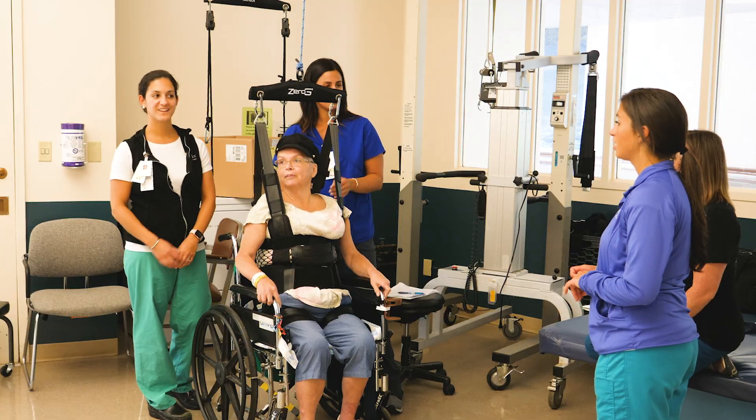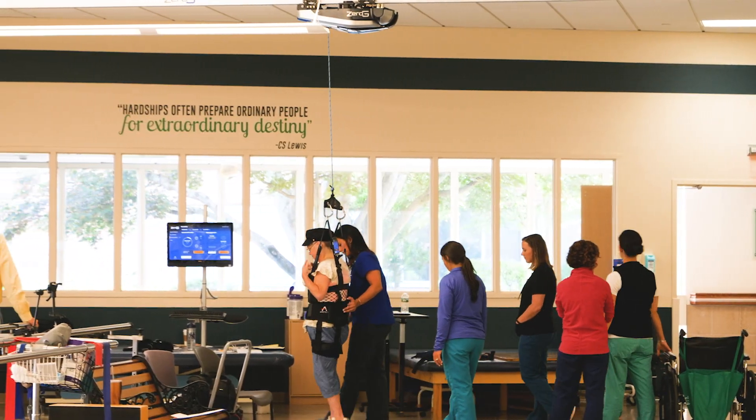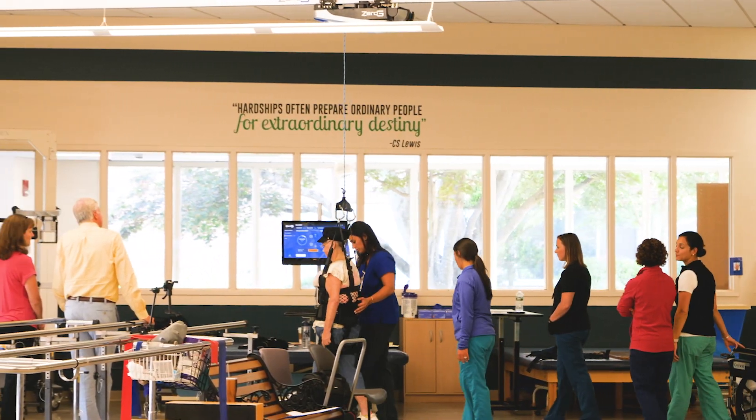Those patients that might have a fear of falling can now get up and you can show them that they physically won't touch the ground. The machine will save them, and that really does help because once a patient is afraid of falling, it really does hold them back sometimes.